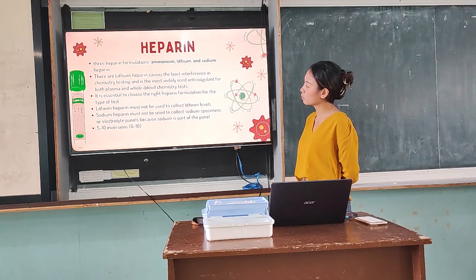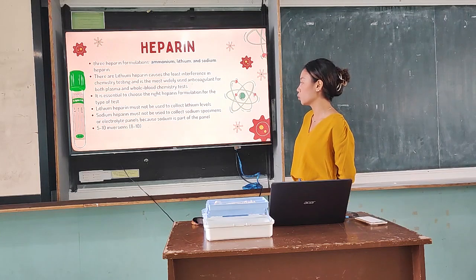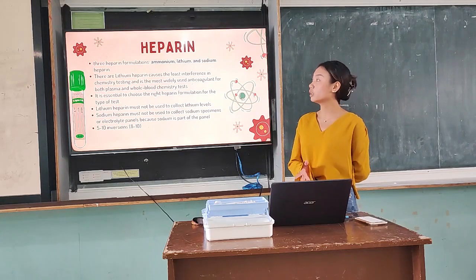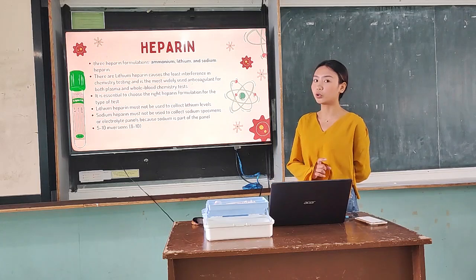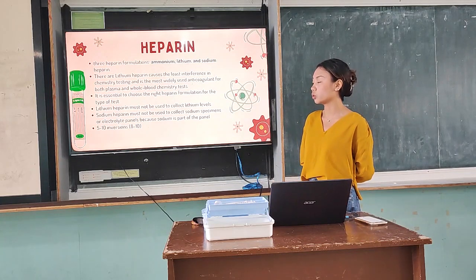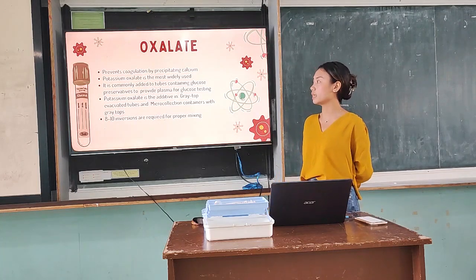Lithium heparin must not be used to collect lithium levels. Sodium heparin must not be used to collect sodium specimens or electrolyte panels because sodium is part of the panel. So kanina, di ba, yung sa previous tops natin, sa lavender 8 to 10 inversions, yung sa black and blue we have 4 to 5, 3 to 4 inversions. Here naman sa heparin, kailangan natin ng 5 to 10 inversions or 8 to 10. Preferably.